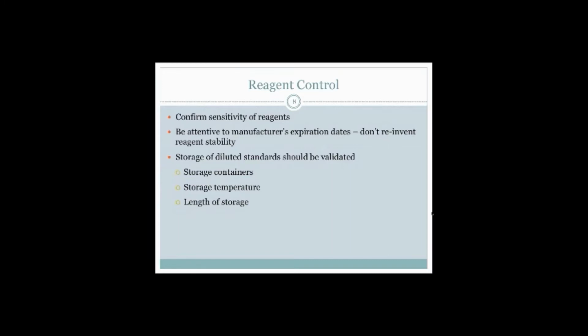Are you going to store them at room temperature? Are you going to store them in the refrigerator? How long are you going to store them? So all of those conditions must be validated. Again, storage of the concentrated standard would go by whatever the lysate manufacturer recommends, but the diluted standards should have their own validation.